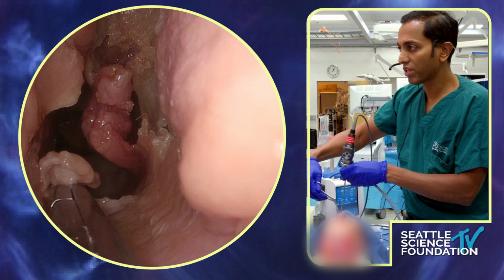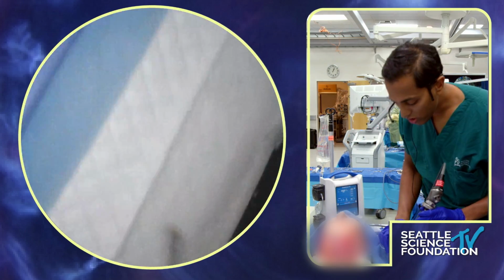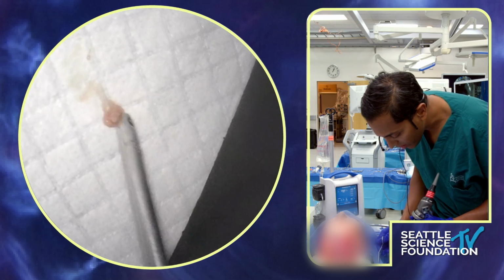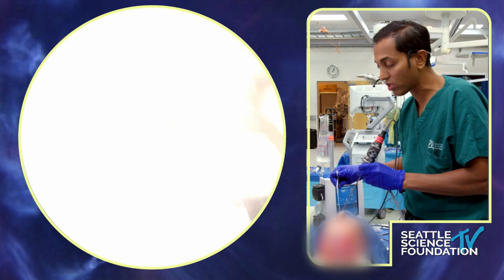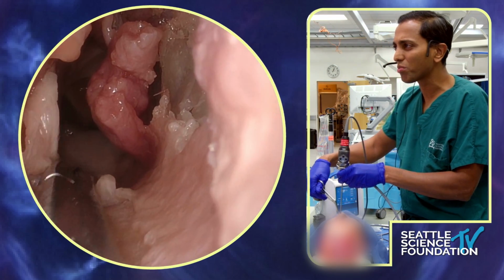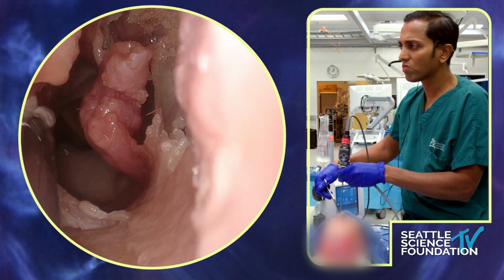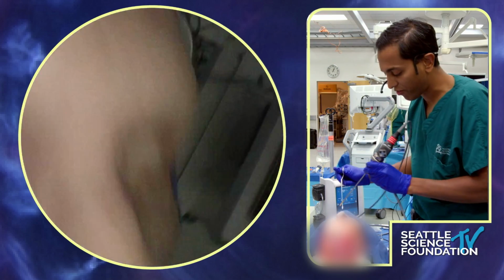And we'll just kind of tear it here just to get that graft going. So these grafts are small. They're really not huge grafts. You don't need anything big there, but essentially you want a nice little graft there. And then here, I tore it a little bit, but we'll see if we can get that graft going or not. So that'll be a free graft there.